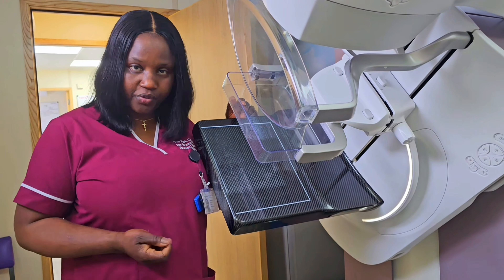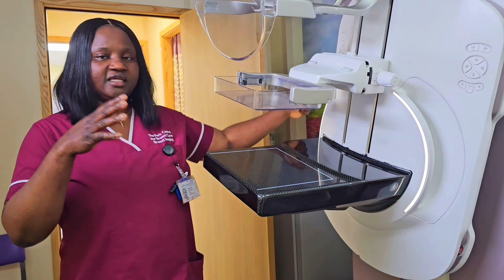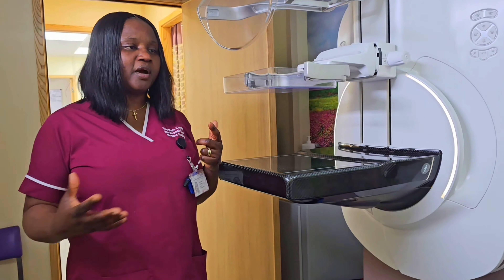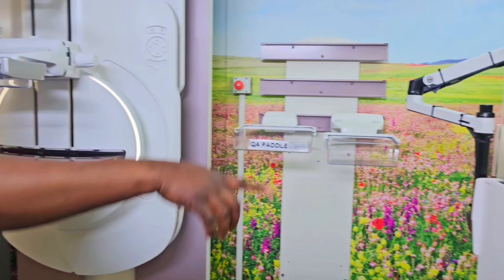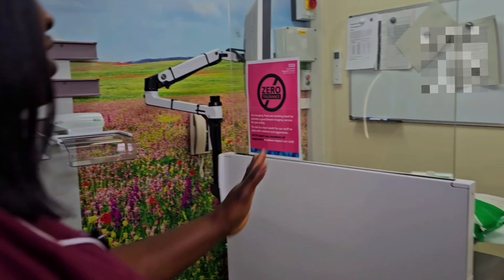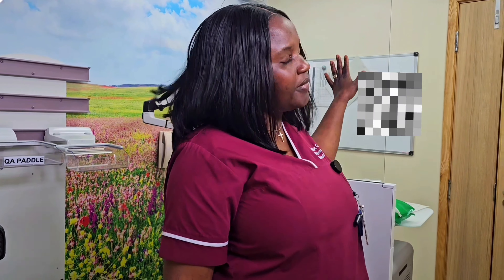After you are done taking these images, the mammographer will hide behind a screen — called the console — to take those pictures. After your mammograms, you are then told that your results will be sent to you in about 2 to 4 weeks.